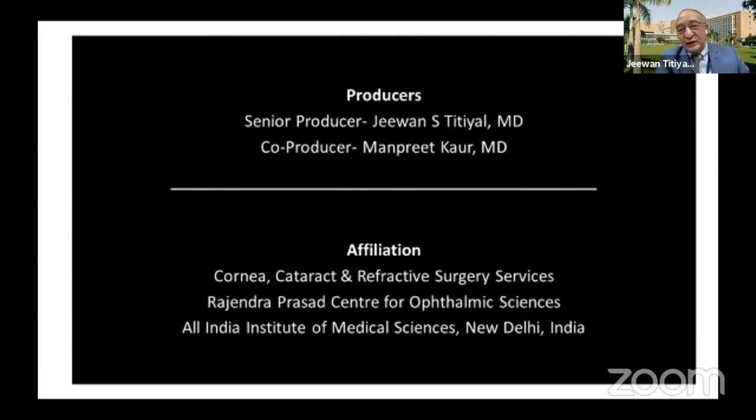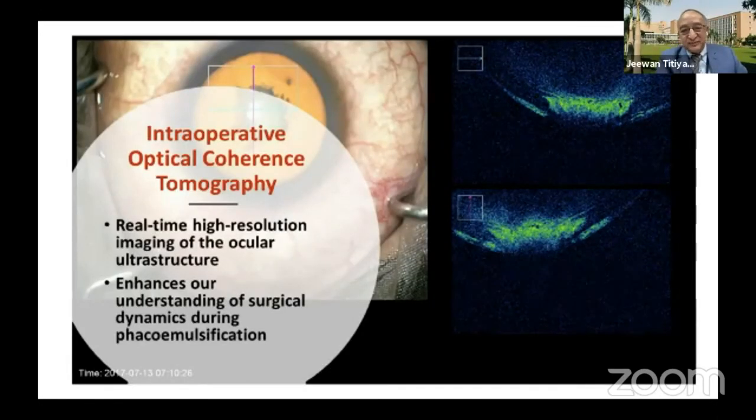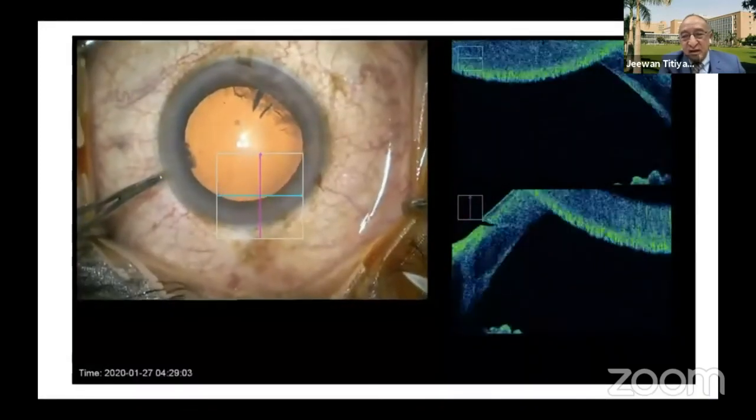Looking into an intraoperative OCT, or an OCT in pre-op preparation, is always going to help us in deciding the type of cataract we're dealing with and what type of surgery we're going to do subsequently in those cases. And intraop OCT does give you an assessment of the steps you're going to take, and the dynamicity of each step can be checked. So it's a very high resolution imaging which you can acquire during your surgery with intraop OCT microscopes. Definitely it's going to enhance your understanding, and it can give you all the pictures.